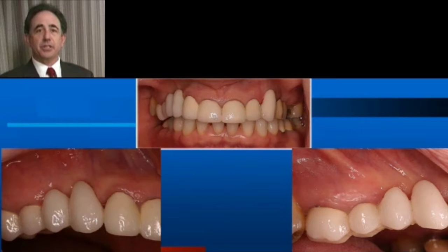This patient had tooth extractions, the sites collapsed, and you can see where pontics are present under the fixed bridges. You can see very large and unaesthetic pontics that do not look like natural teeth emerging from the dental gingiva, as we would like either with our fixed prostheses pontics or our dental implant supported restorations.